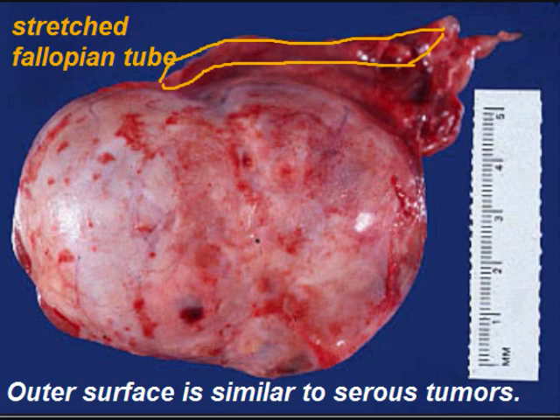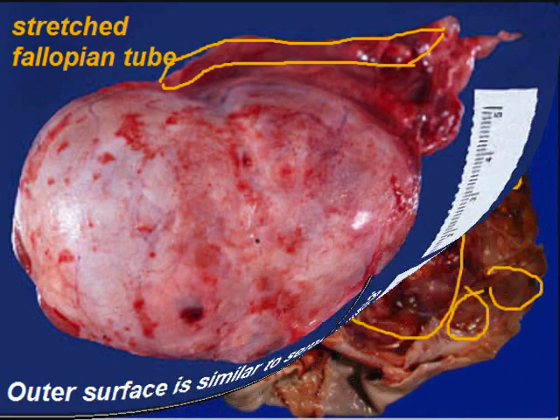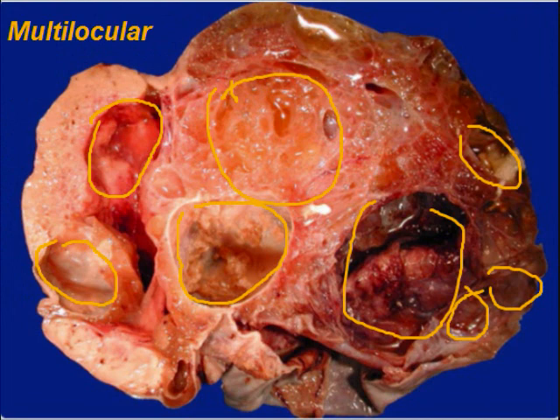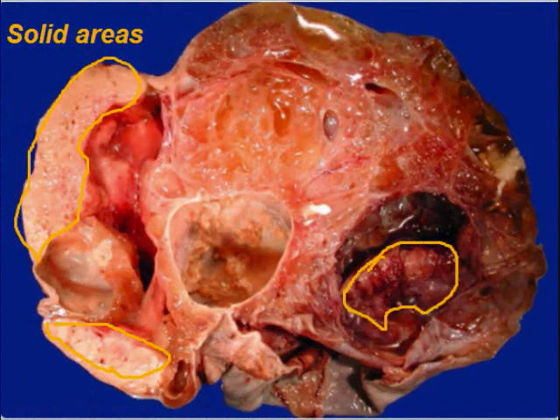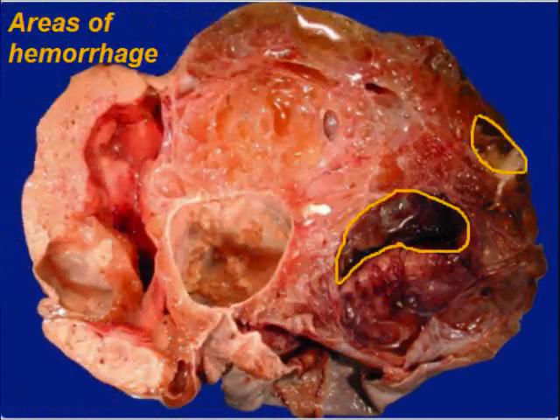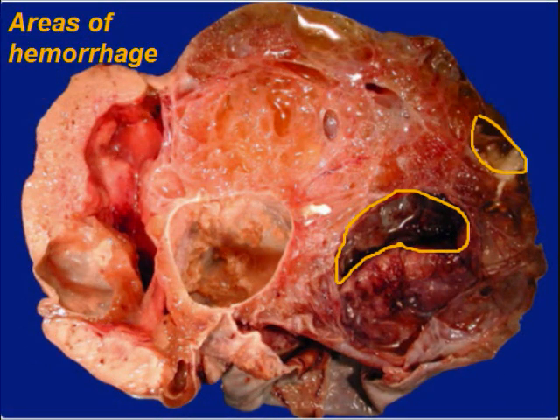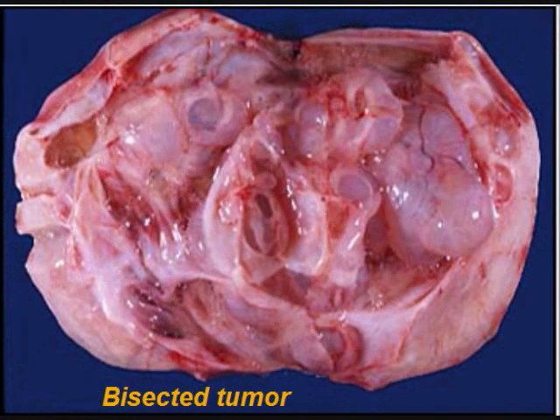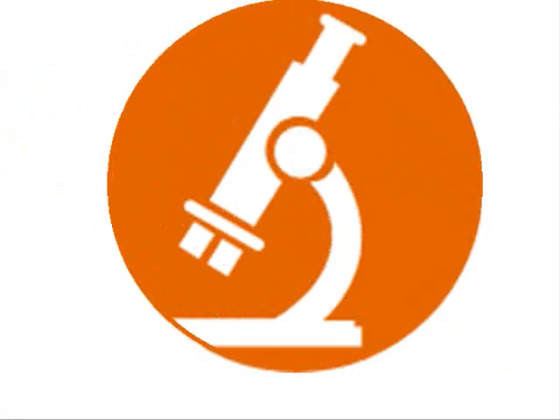This is the ovarian biopsy specimen. It is similar to serous cyst adenocarcinoma, but when you cut it, it is multilocular. You can see there are multiple fluid-filled pockets as well as solid areas, and there are areas of hemorrhage. So it is partly solid, partly cystic, filled with thick mucinous fluid. For comparison, this is a benign mucinous tumor — you can see there is a thin-walled loculi and there are no solid areas.